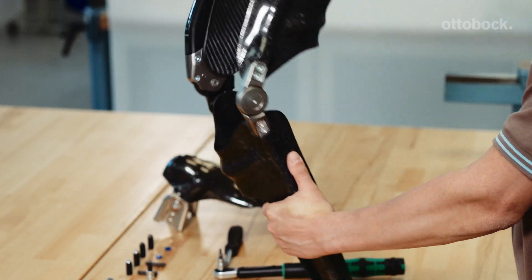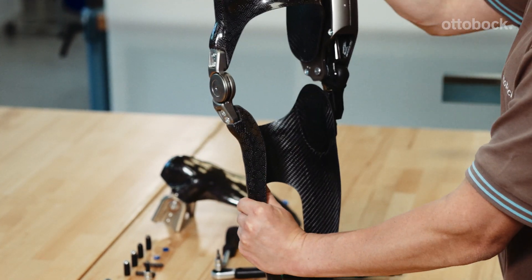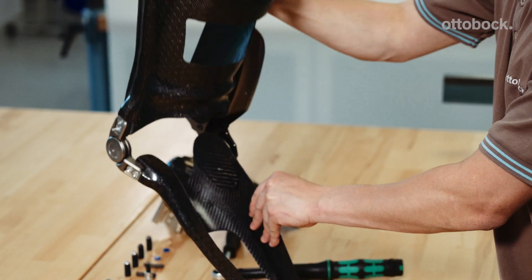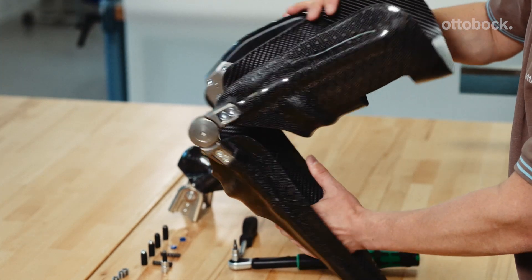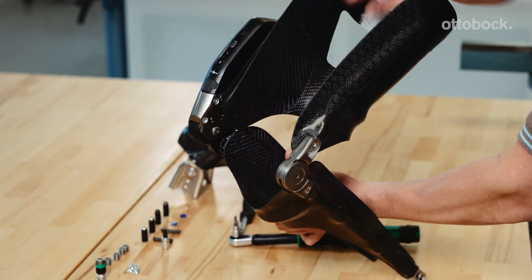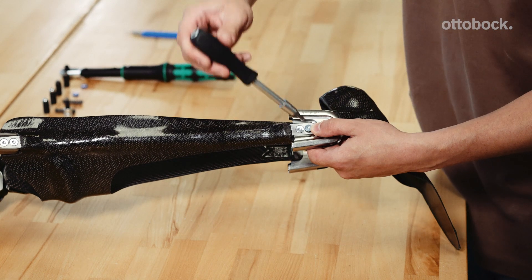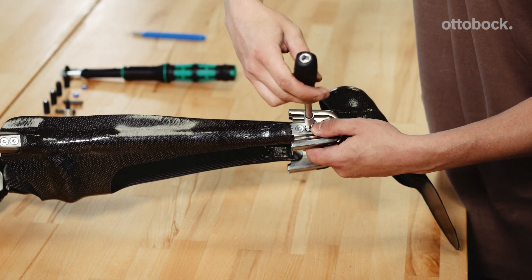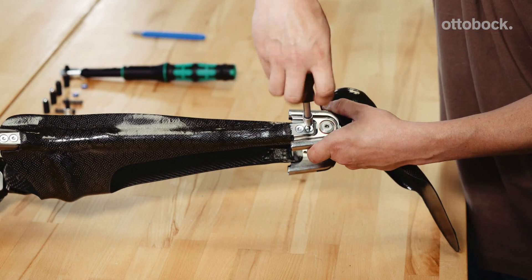Make sure that the orthosis shells do not collide with the joint module at full flexion. If this is the case, part of the thigh or lower leg shell has to be sanded back. Mount the foot component with the ankle joints and fill the gaps beneath the lamination bars with petalin or foam.